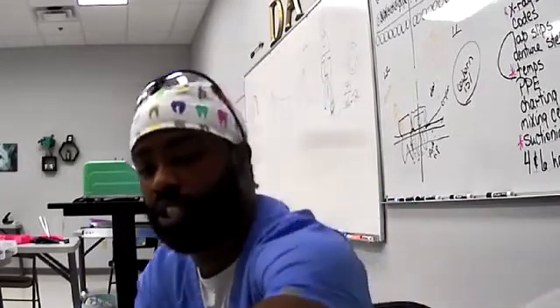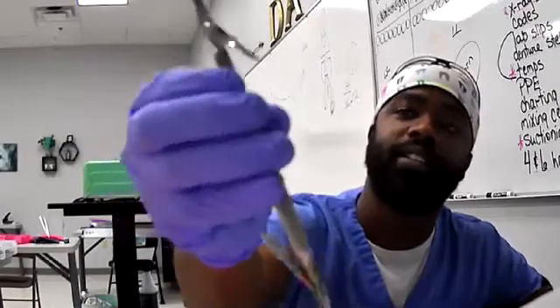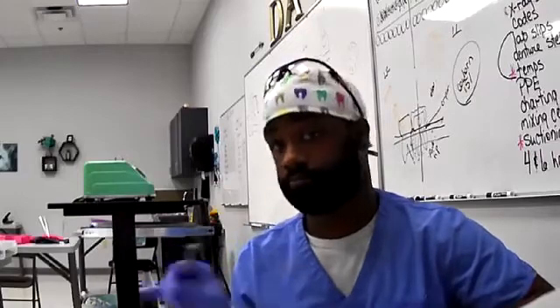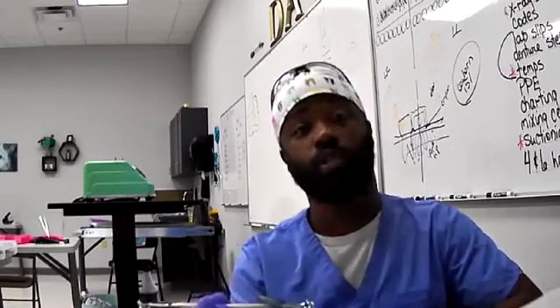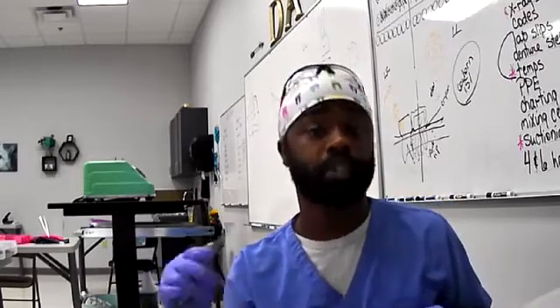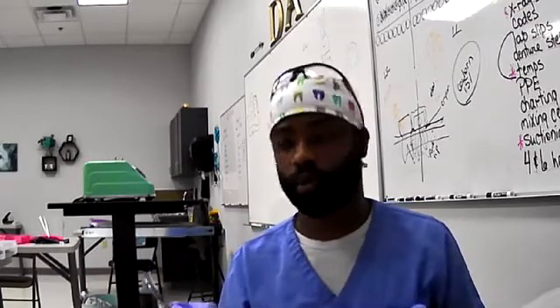So once it's shaken pretty good, you get your amalgam carrier. It's got two sides. One side of the carrier is bigger than the other side. What I do is I pack both sides at the same time. I'll pack the big side first, flip it over, pack the small side, and then I see which side the dentist wants. If you're doing a smaller tooth or the prep was small, you're really not going to need the big hole because it's basically not even going to go into there. So, judge based off of how big the dentist's prep was.